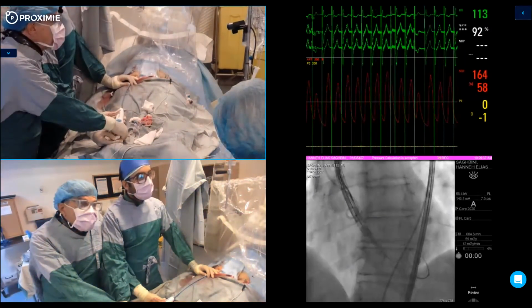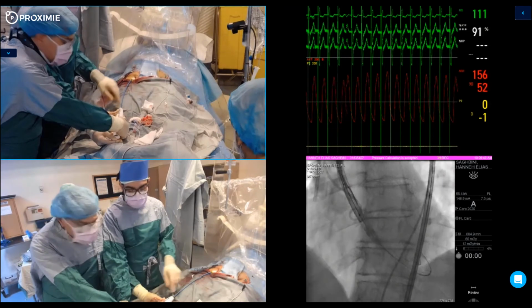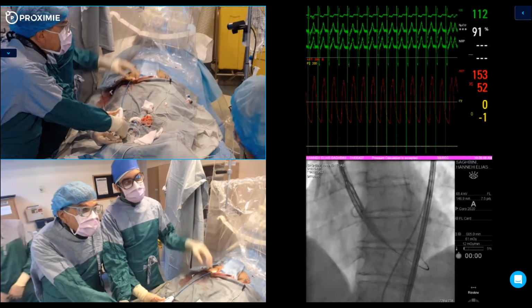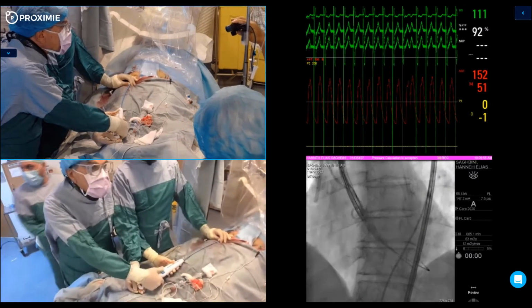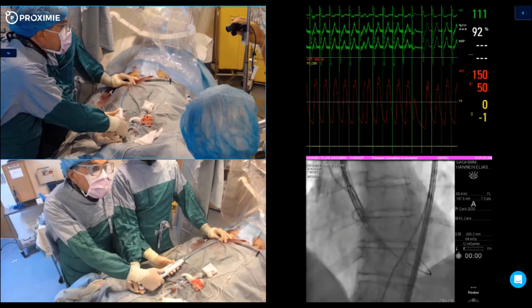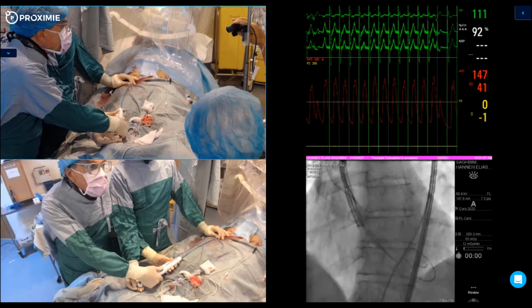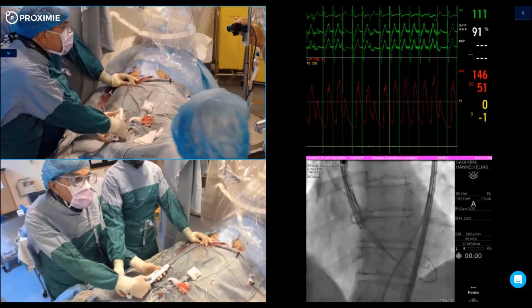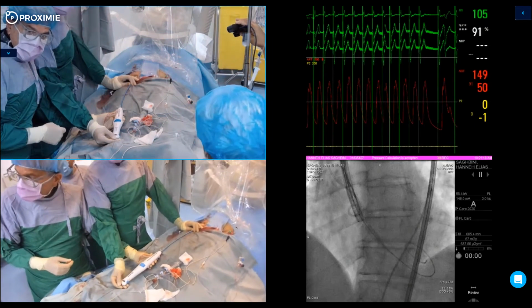Okay. So now Ziad is going to start to unsheath, and you can see this is the knob. It's very easy, ergonomic, and very easy to do. Okay. So we'll have to go slow at the beginning. Actually, we'll unsheath from the capsule, and then we'll go very slow. So now the capsule is coming out. The target in this valve is not 2 to 3 millimeter like with the Medtronic. It's more 5 to 6 because it's smaller. And it has a relatively low radial opening force. So if we're going to post-dilate, it might pop out.